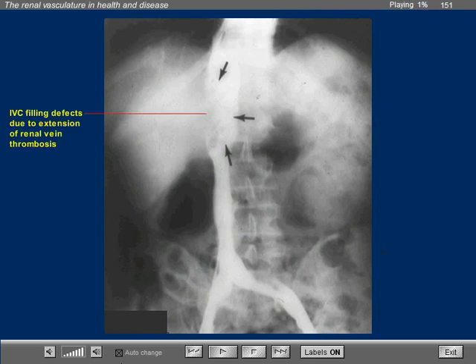In this patient, we did an inferior vena cavogram, and note that there is a very extensive filling defect at the entrance of the renal veins and occupying the hepatic segment of the inferior vena cava. Note the absence of streaming of unopacified blood that should be seen in a normal examination. This is pathognomonic of inferior vena cava obstruction with renal vein thrombosis.